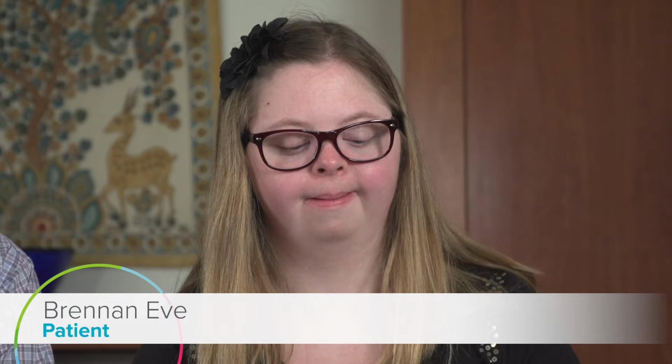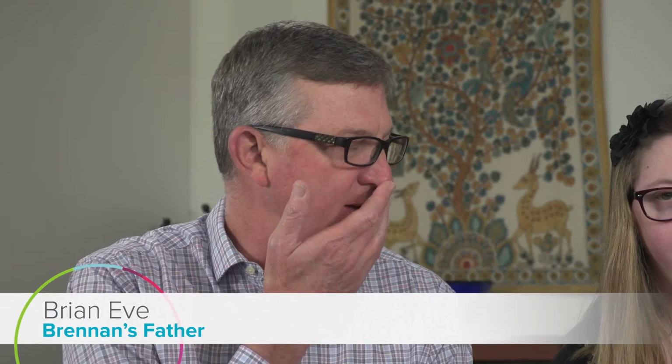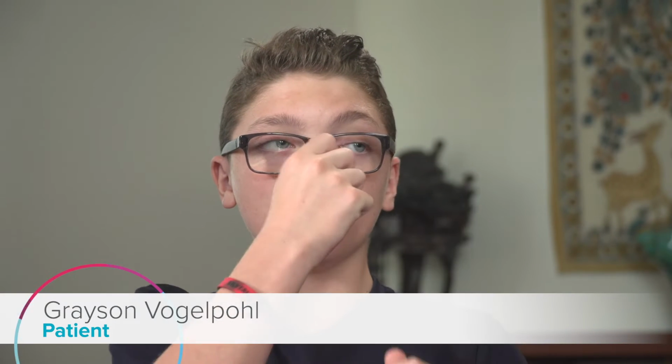When I take my mask off, I do have some marks on my face, but it goes away very quickly when I get ready for the day. Sometimes she might get just a little bit of chafing in her nostrils, and that's why she's also diligent about using her nose spray each and every time. Usually I just don't turn my mask off and just fix it from there, because I find it difficult if you turn your mask off and try to adjust it, because you can't really breathe when the air's off.